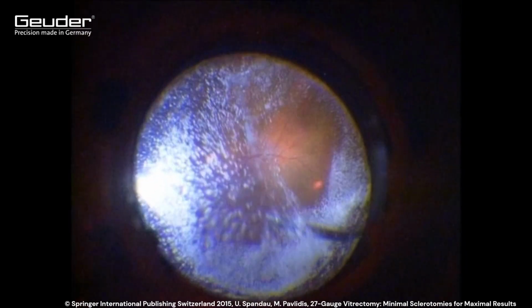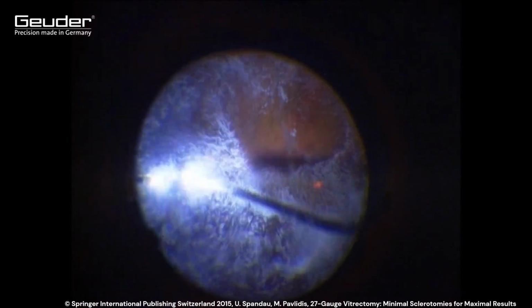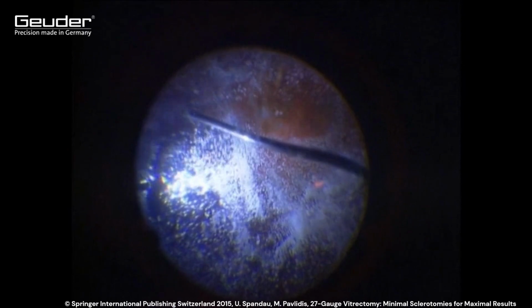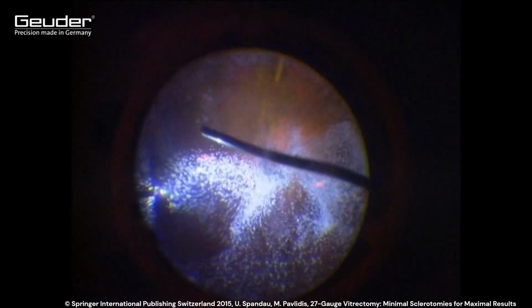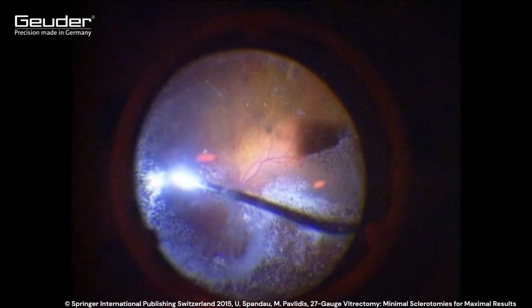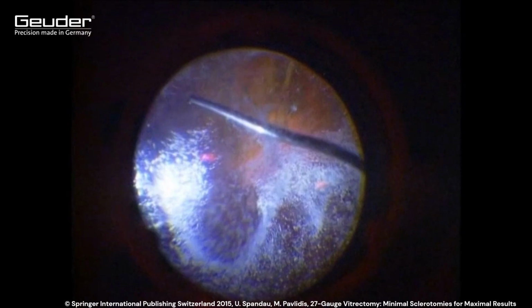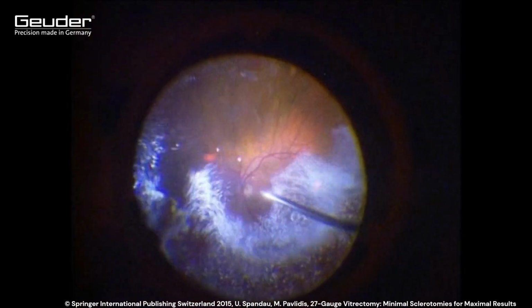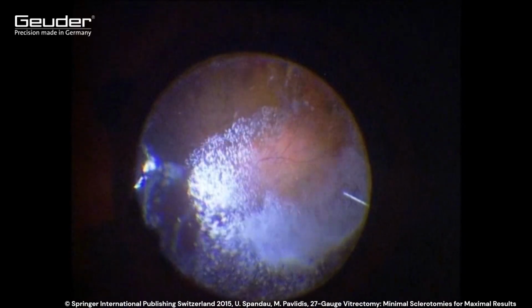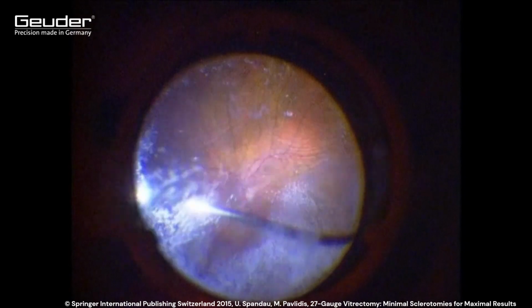The vitreous body is a transparent gel-like mass consisting of 98% water and 1% each of hyaluronic acid and collagen fibers. In order to be able to clearly show the process of the vitrectomy, this video was explicitly chosen. This is an asteroid hyalosis, a degenerative phenomenon in which small milky white opacities form in the vitreous. With this indication, the vitreous body is better represented.